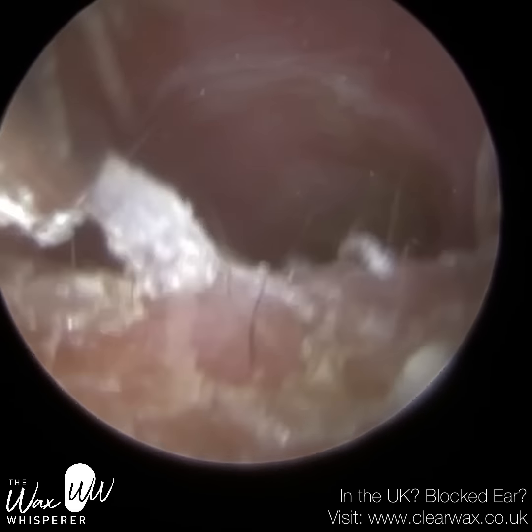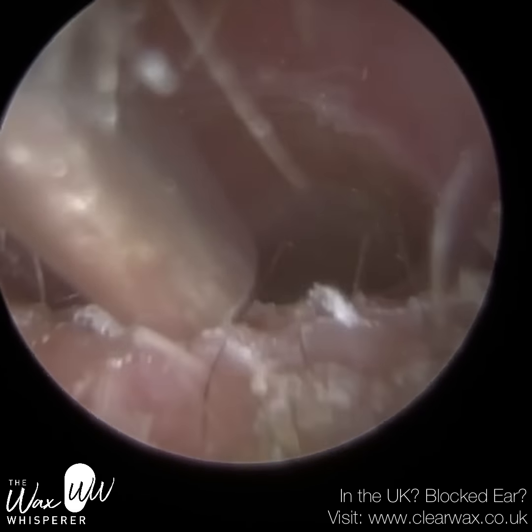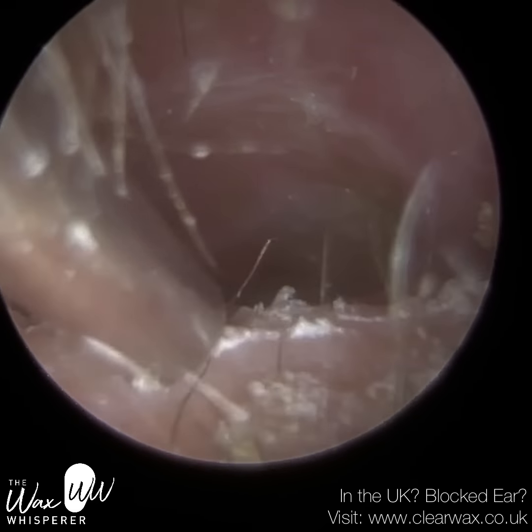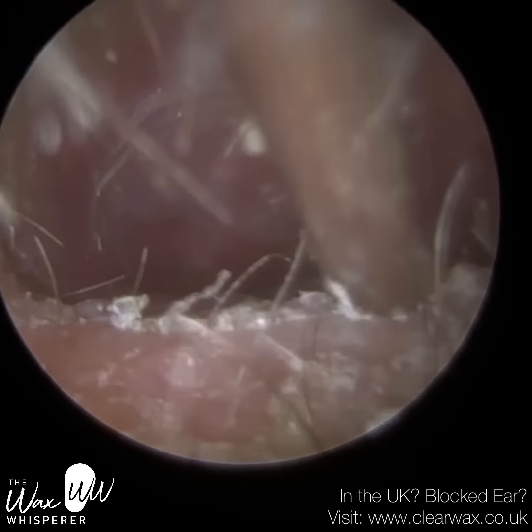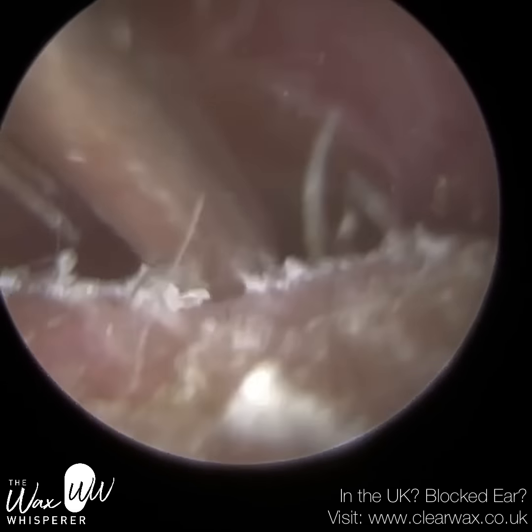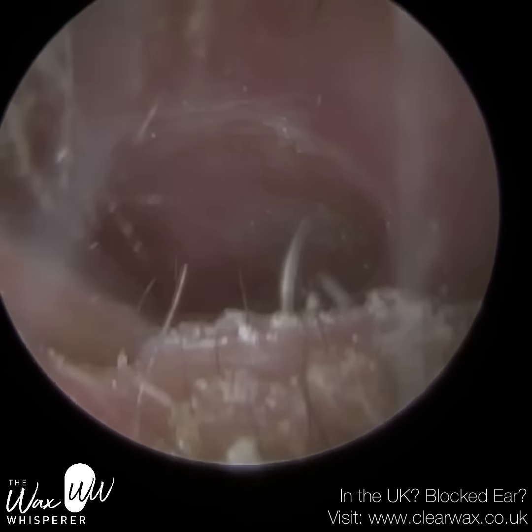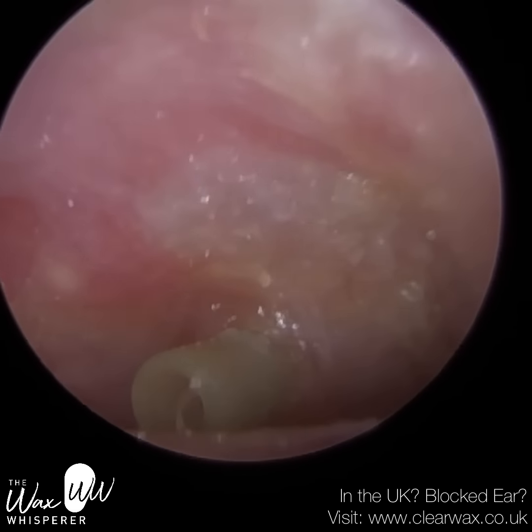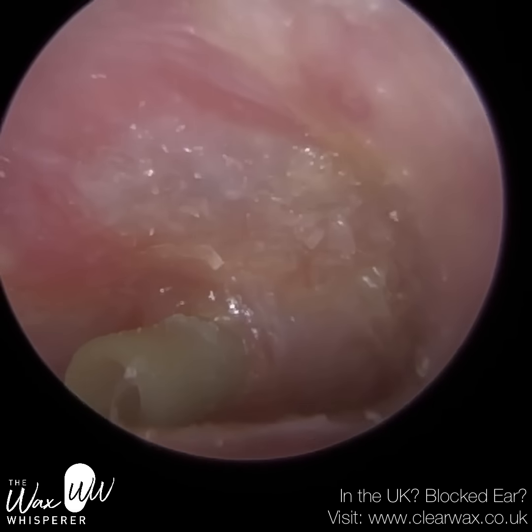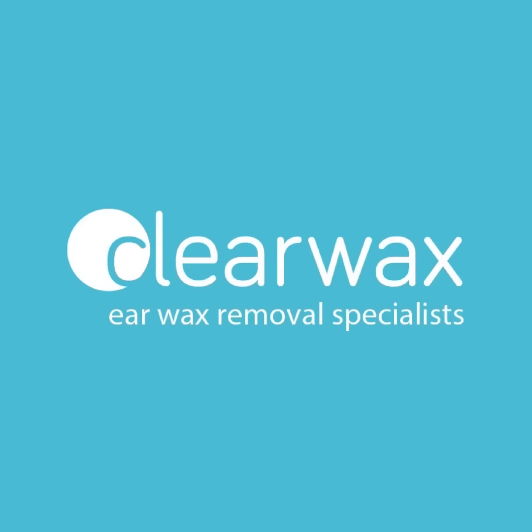And also your normal over-the-counter earwax drops like olive oil spray, which can be good for dry skin, the patient's not able to really use those, although recently the ENT surgeon said it's okay to use them once in a while. Because even olive oil or sodium bicarbonate, if you read the instructions in the packaging, it advises not to be used if you've got a hole in the eardrum. But as you can see, we've cleared all the dead skin, and the T-tube's patent, it's not blocked, and the patient feels a lot better.